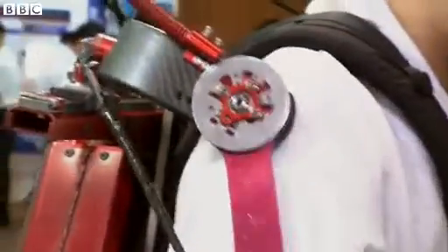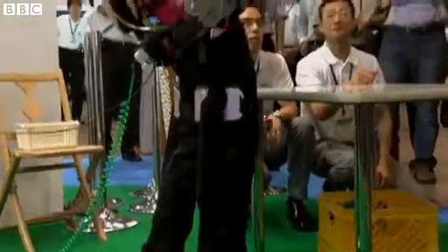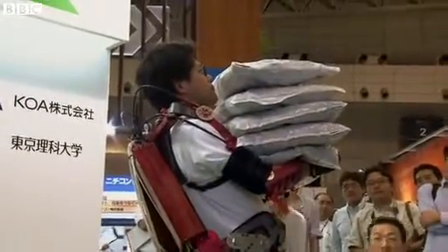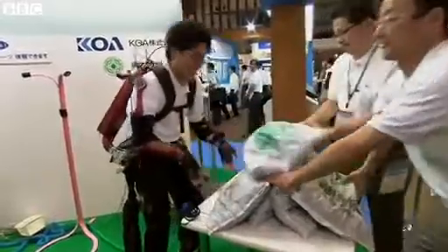And if you're properly trained, you get to wear the red suit. That's the full-body contraption with arm and leg support that's allowing this chap to lift 50 kilograms. And just to prove that it's the suit doing the work, this is what happens when you switch it off.